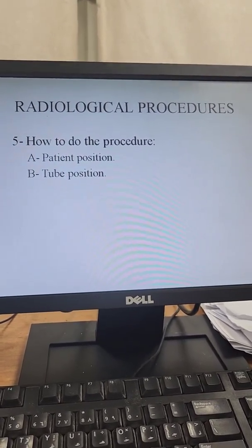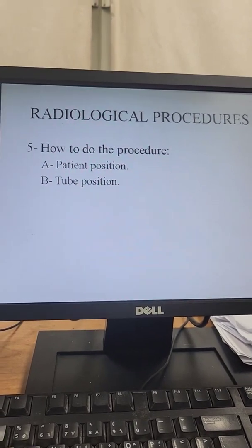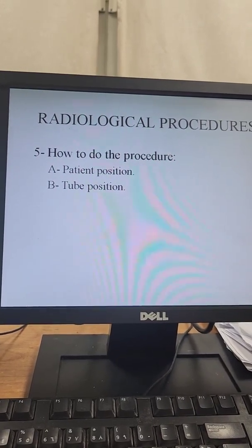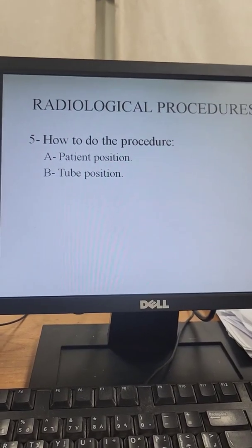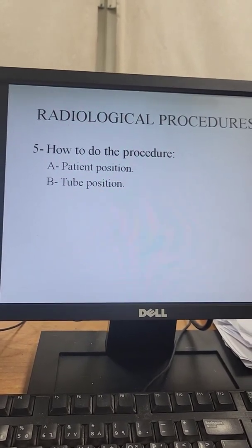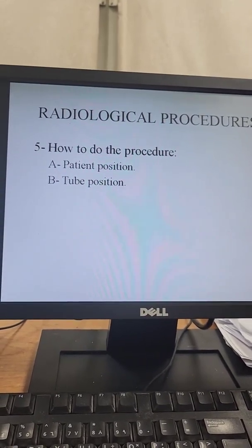pulmonary artery and measuring when maximum contrast opacification of the pulmonary artery happens, and this will be the best timing for radiological study. So we are adjusting the machine to start at this timing post injection. This is test bolus. The other technique is bolus tracking.